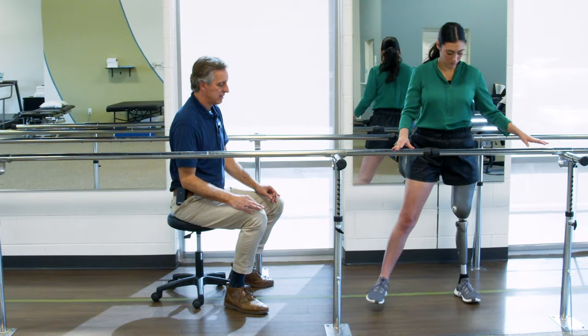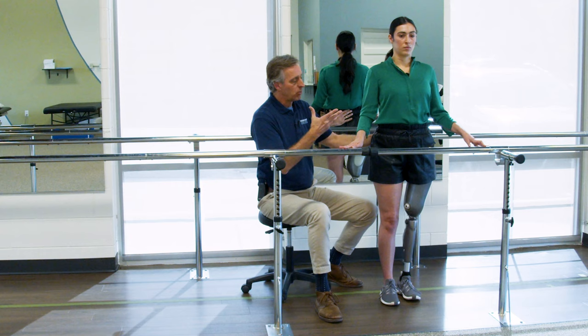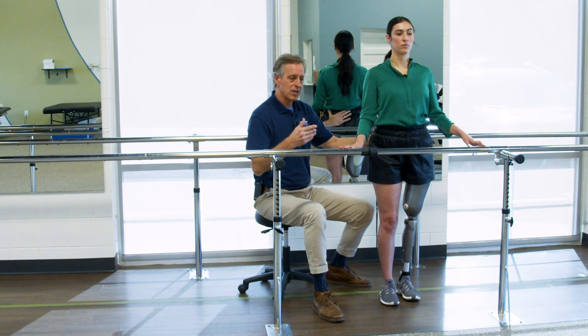Excellent. So if Tracy's got that, and again, she makes this look easy. Over time, we have to work with these types of things and give people lots of repetitions of getting the idea of motion. But once she's got it and says, okay, I got how to sidestep, and I can level my toes up, the next progression is I want to get into more stance time on the prosthetic.